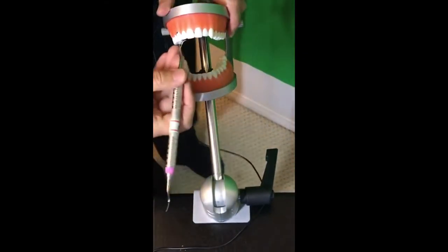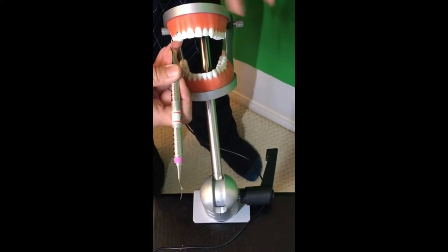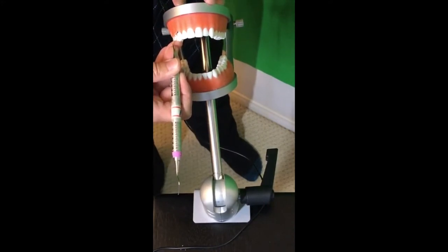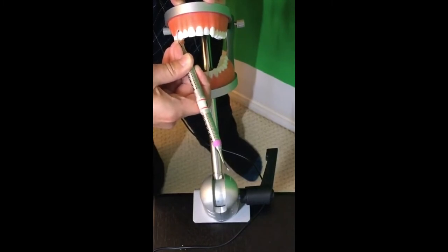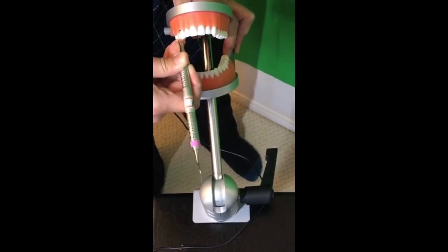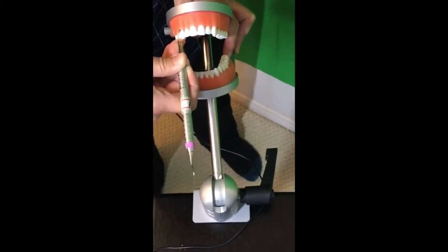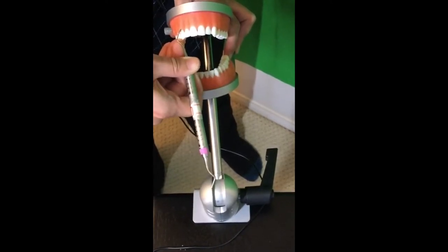Insert nice and gently subgingivally, feel the base of the pocket — just pretend it's around 3 to 5 millimeters — and then perform exploratory strokes. Grab the calculus and activate again at the toe one-third. I have some big supragingival, but I'm going to focus on sub right now, and then rotate around. Remember, the handle of the instrument is parallel to the long axis of the tooth. This is 90-degree angulation to the shank, so you have to create your working angulation — your shank will be a little bit closed.